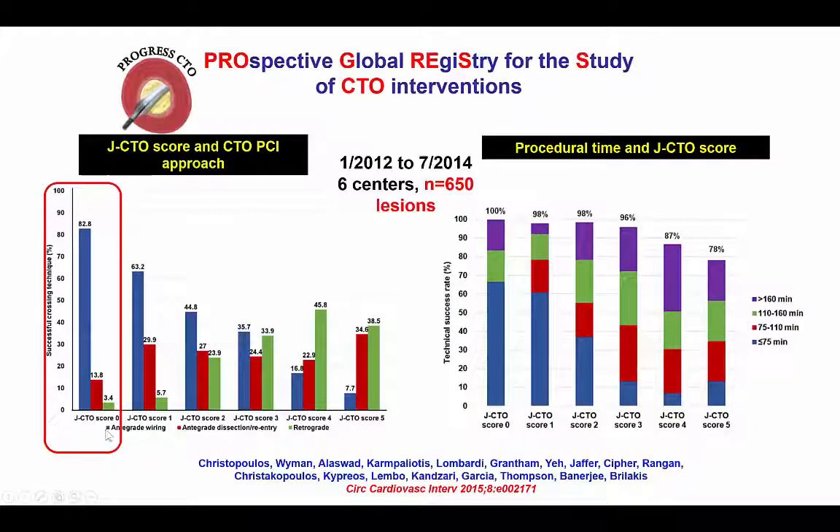This case illustrates that what appears to be simple — for example, a JCTO score of 0 or 1 — may actually be more complicated than it seems. In those cases with JCTO score of 1, almost a third will need a more advanced crossing technique, which is either antegrade dissection and re-entry or use of the retrograde approach. That is exactly what happened in our case.